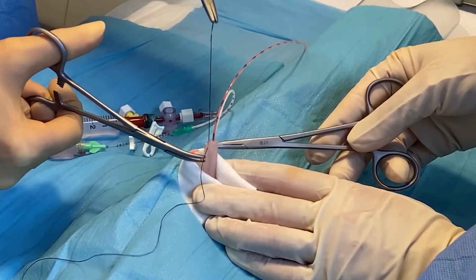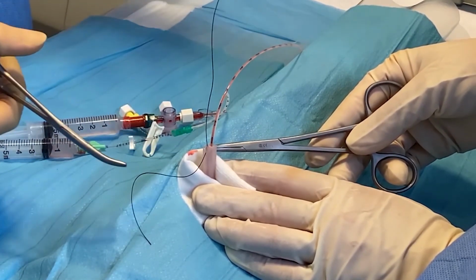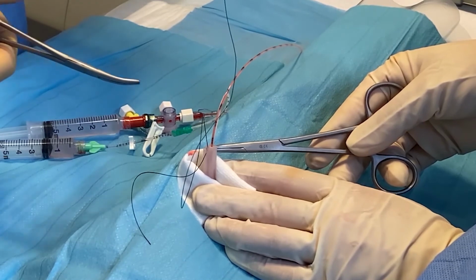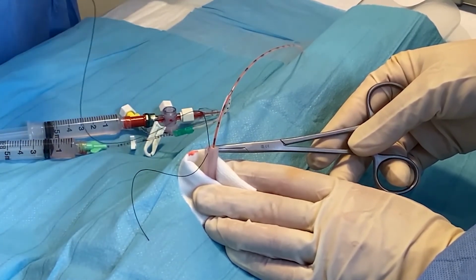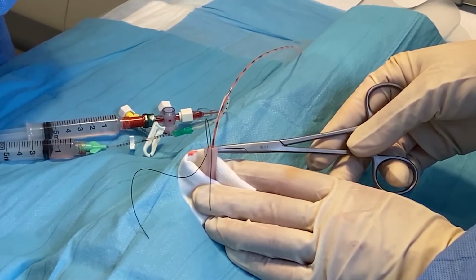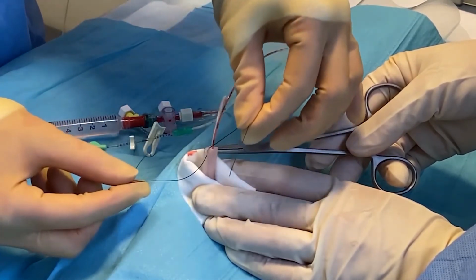And pull through all the way, but make sure you leave a good length to knot the suture, and then it will need to be sandwiched in between elastoplast to secure it. And then I'm going to cut it with scissors. And it's easiest to tie it with your hands.